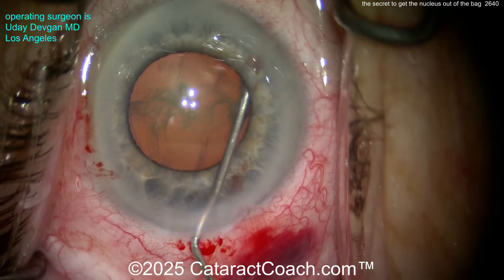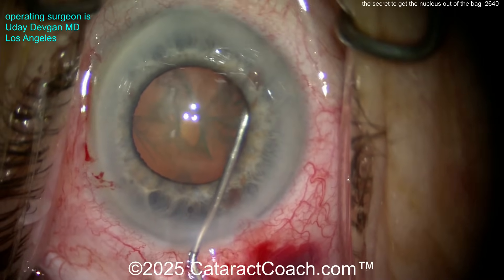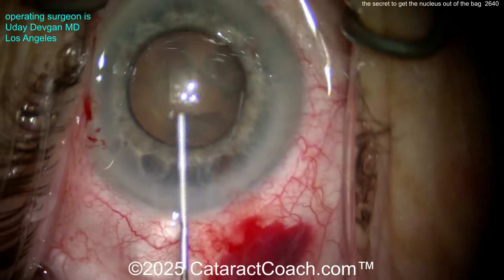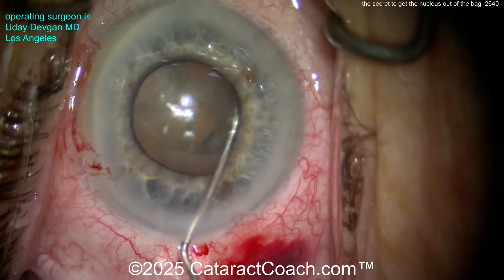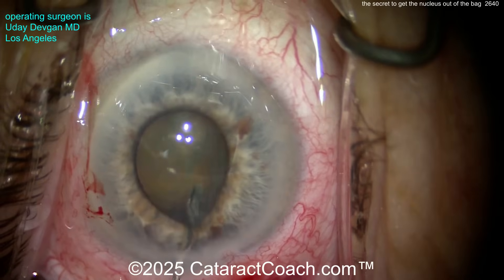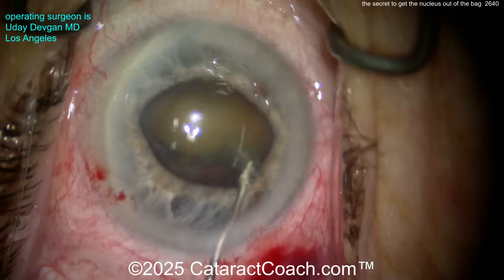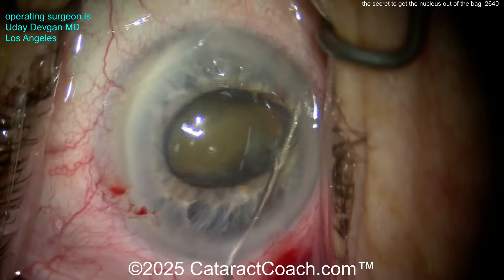Watch carefully. To the side, we inject a 27-gauge cannula with BSS — a little bit more, a little bit more. See how the nucleus comes up a little bit? That's okay, didn't quite come out — we can try again. Let's go to the other side. Don't go down the middle because you'll prevent the nucleus from coming up. Inject a little bit and here it comes out. There's a tendency for a little iris prolapse — that's okay. We don't let the iris prolapse though; we manage the fluidics. Now you've got the nucleus partially out of the bag, and using that cannula to tilt the nucleus up more.